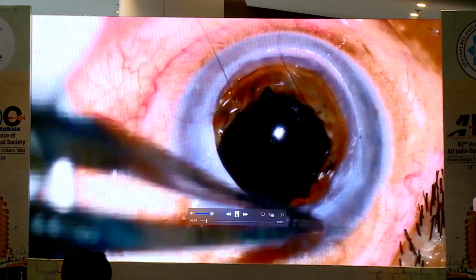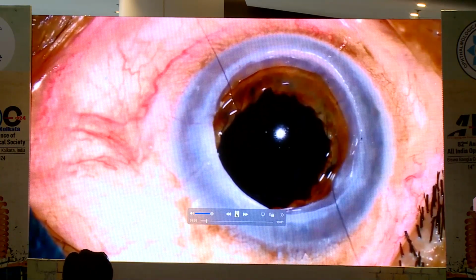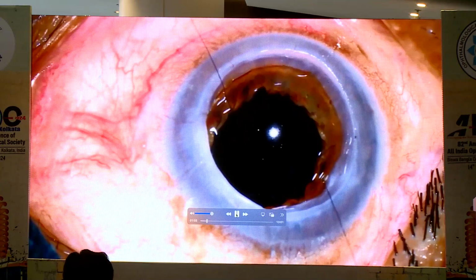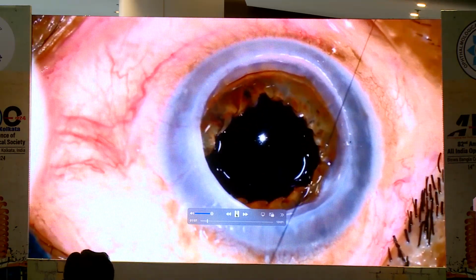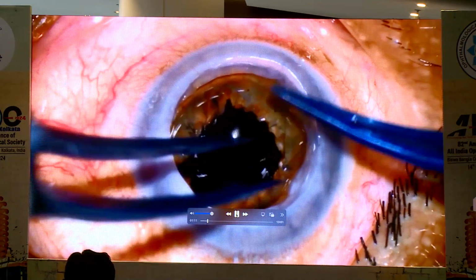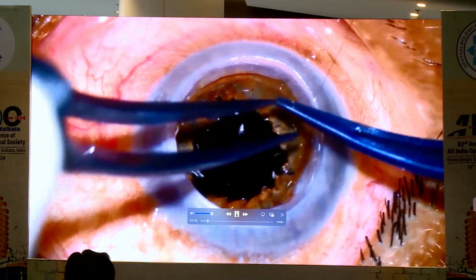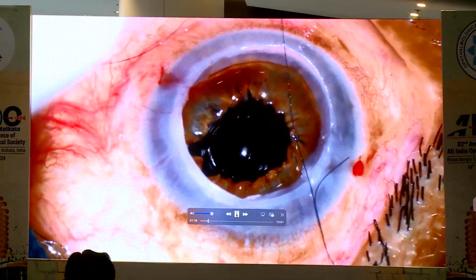So you don't have much time to leave it in this open sky condition for long. You have to finish the surgery as quickly as possible. You can see, after passing the Siepser technique for pupilloplasty, you just tighten it, and at least you will be able to constrict the pupil, and don't tighten only this one thing.